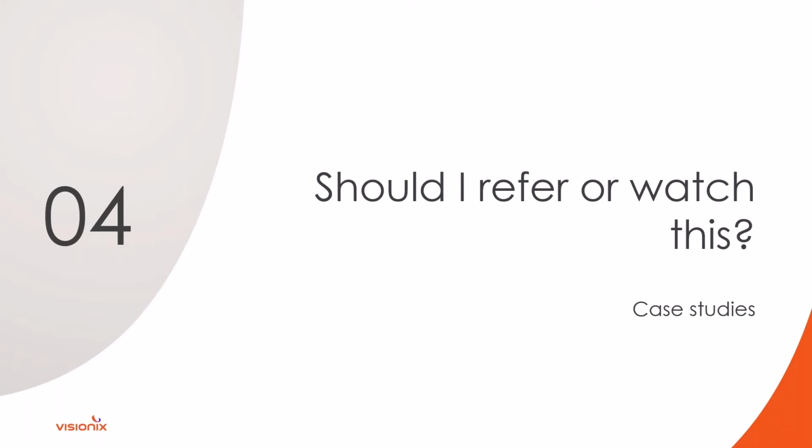When it comes to macular degeneration, when it comes to vein occlusions, things like that, what is our job? It's often that we're making the decision: should I continue to watch this, which we often do, or should I send this out to our fine ophthalmology colleagues, our retina specialists? That's in big part our decision when we're pulling the trigger: should I refer or should I watch this?